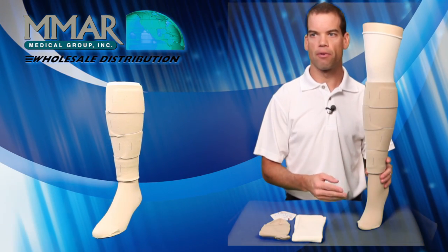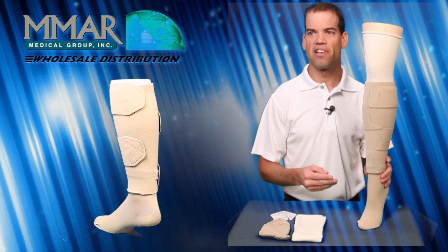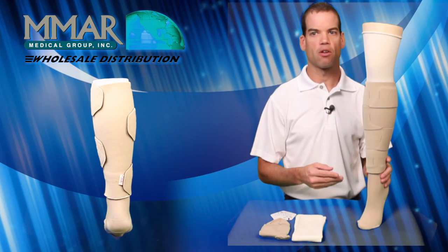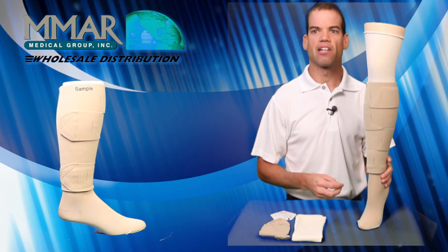Indications for use for the Juxtalite include mild to moderate lymphedema, chronic venous insufficiency, venous stasis ulcers, post-sclerotherapy, edema, and varicose veins.